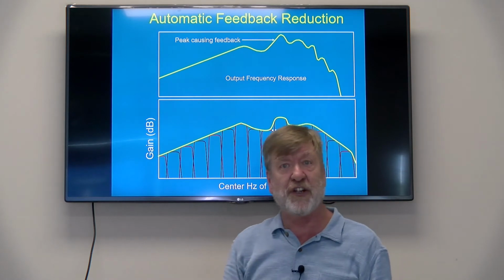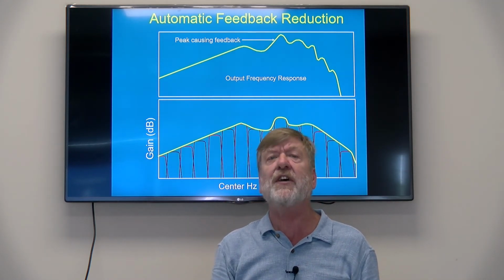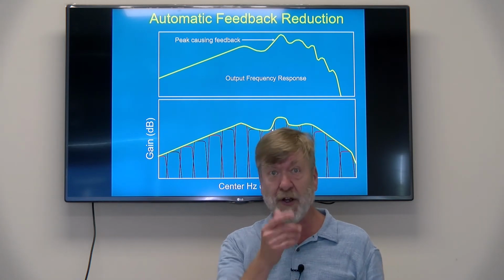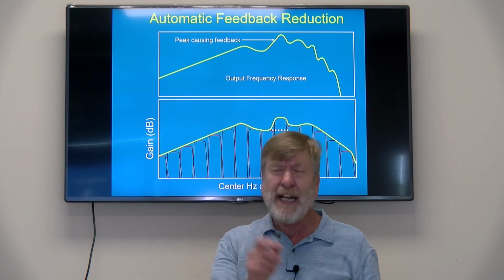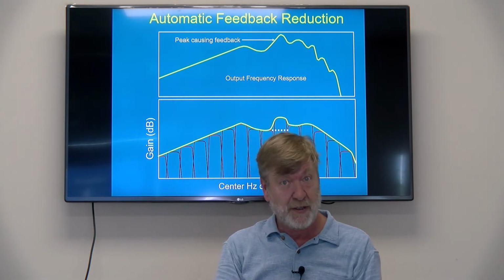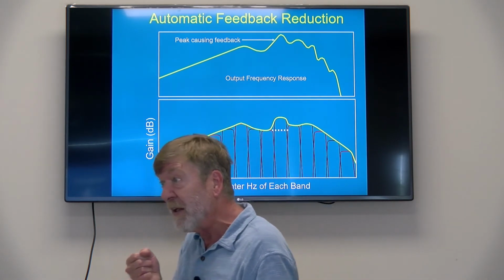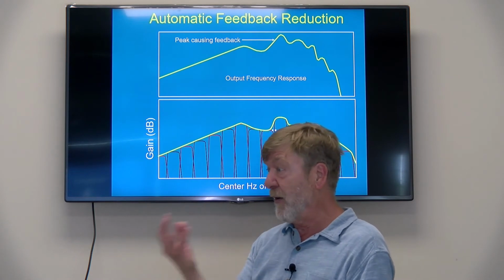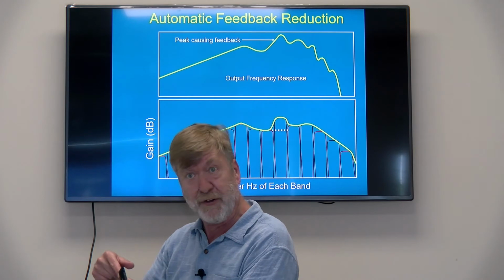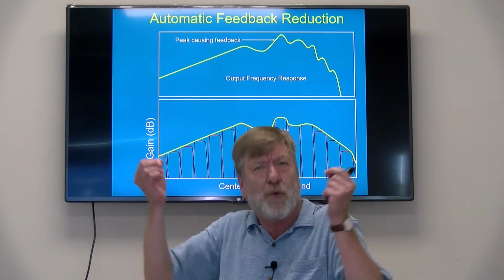Another thing in digital technology is automatic feedback reduction. What's that? The whistling in hearing aids. That's another main complaint. Why is that? Why do hearing aids whistle? Here's why. It's like me talking in a mic and going too close to a speaker. And now not only is the sound of my voice coming into my mic, but now the sound from the speaker's going into the mic. And you're getting a vicious circle there, and you get that shrieking whistle.